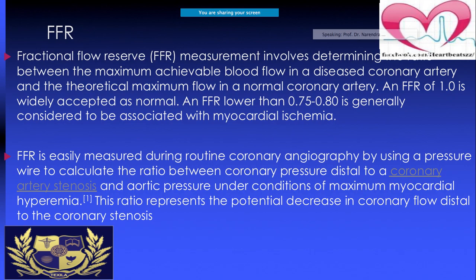Now, coming to the FFR. FFR is a big boon, I would say, for the medical field, especially for the people who are interested in coronary angiography and its problems. The measurement involves determining the ratio between the maximum achievable blood flow in a diseased coronary artery and the theoretical maximum flow in a normal coronary artery. An FFR of 1 is widely accepted as normal. However, if the FFR is less than 0.75 to 0.8, it is generally said to be associated with myocardial ischemia.